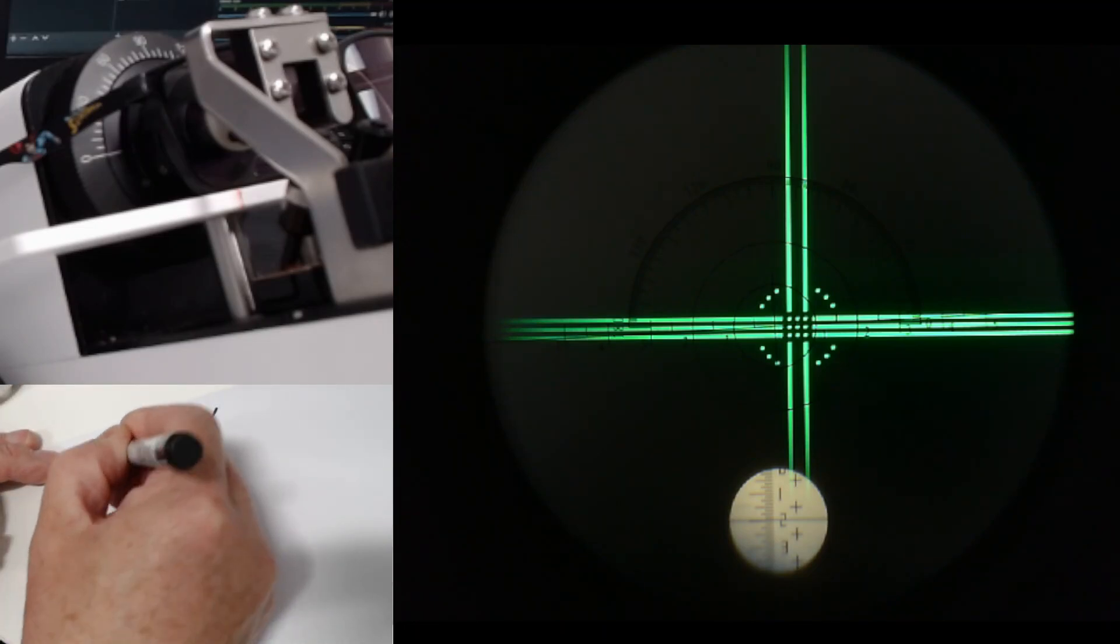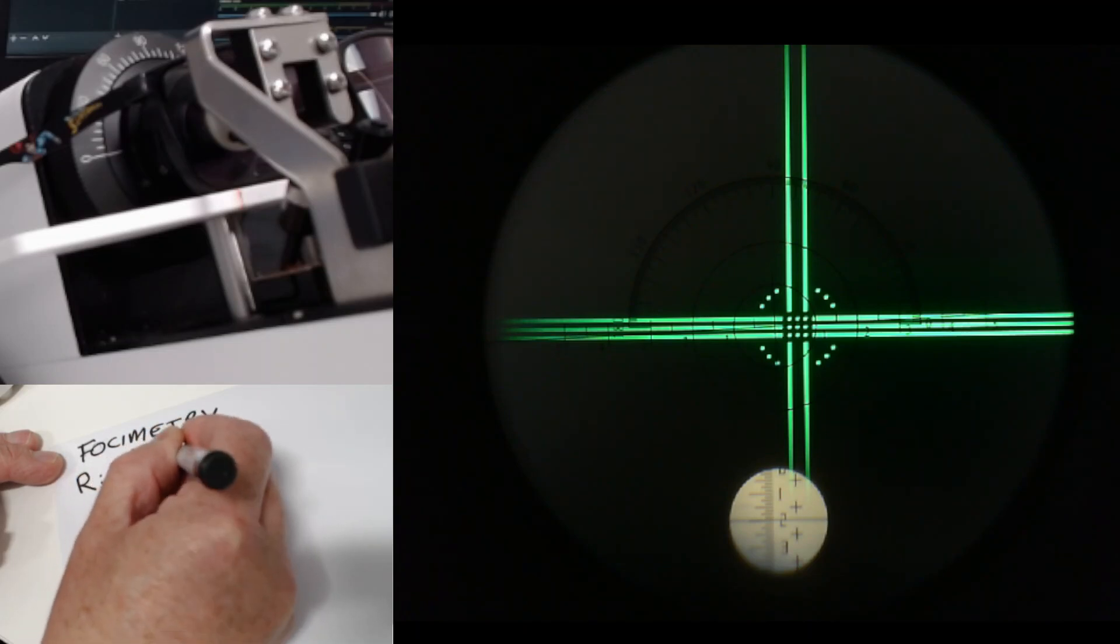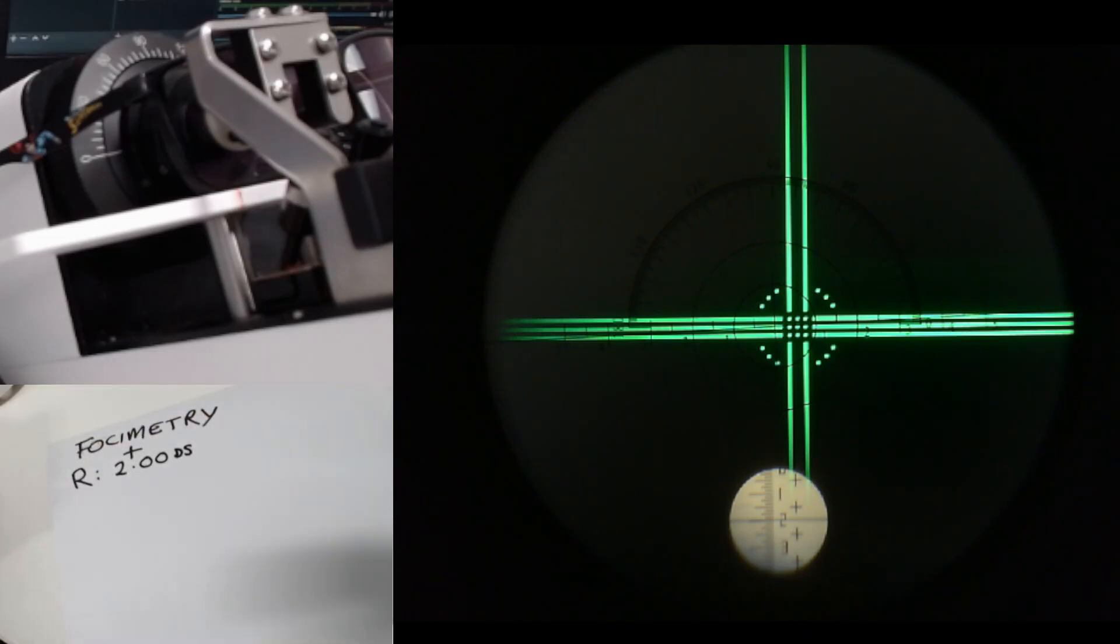I think we can agree that that's pretty much spot on plus two sphere. I'm going to write on my sheet here, right eye plus 2.00 sphere. Remember that every power that you write has to have a sign and two decimal places. Anything other than that is going to be wrong and will be marked wrong.